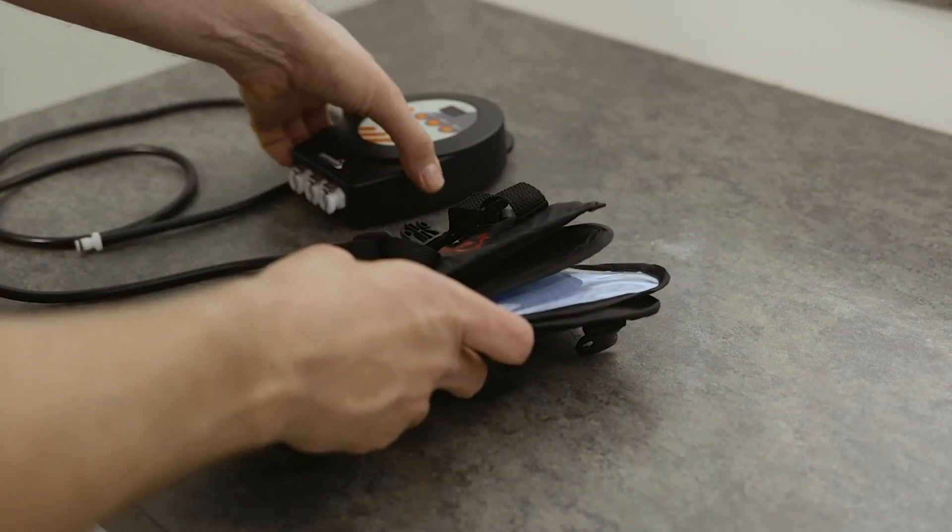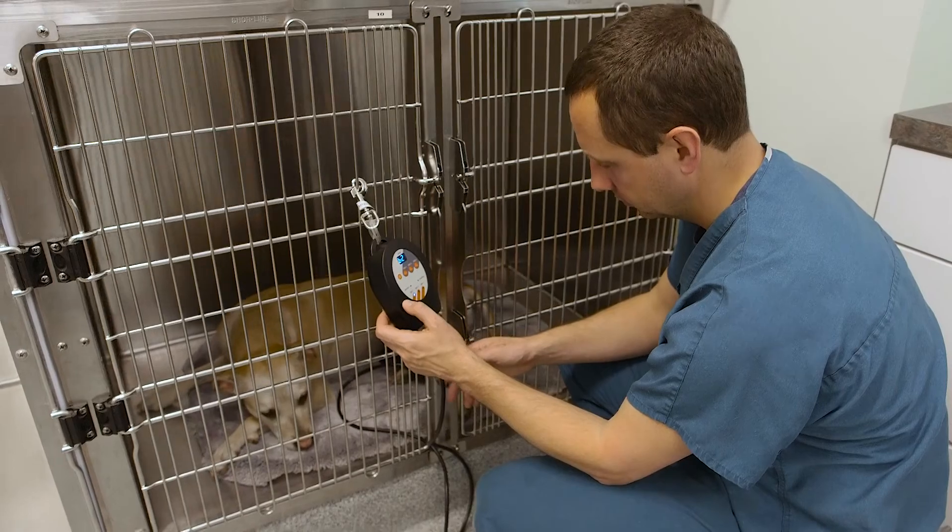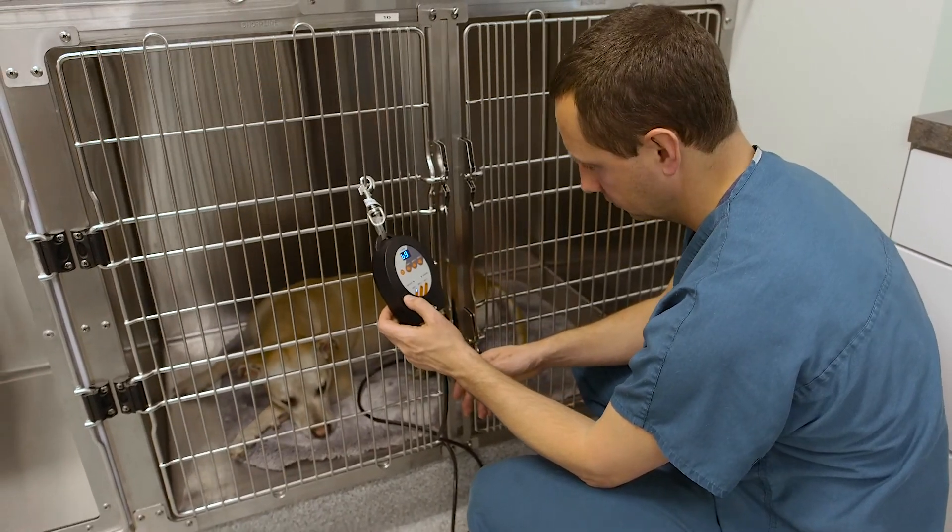The companion cold compression system has become a standard of care in our hospital, not only in surgery but also in our rehab department. Its versatility, portability, practical applications, and results help our patients achieve the goals that they want to.